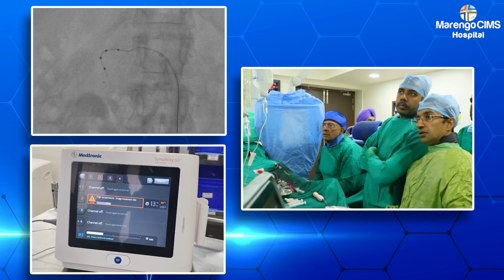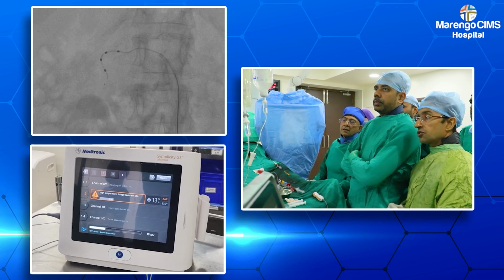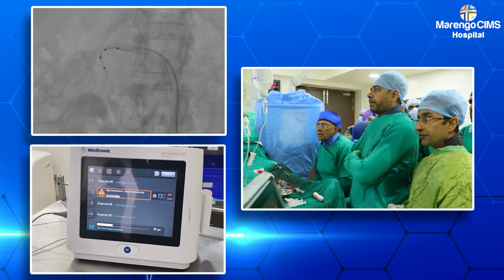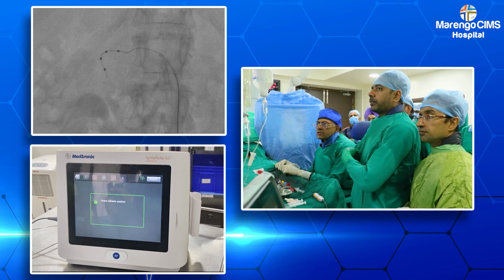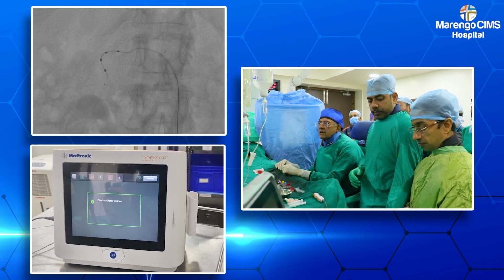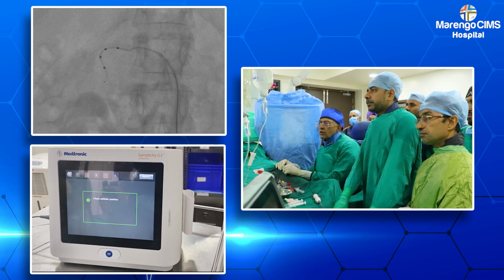High temperature. So as you can see now, the temperature has gone up to 66 and the machine has switched off the electrode on its own, which is the AI based safety feature of the machine, of the catheter. As you see, some ablation took place, but again you have to understand this is the artery, there is some spastic component here which may not be obvious.